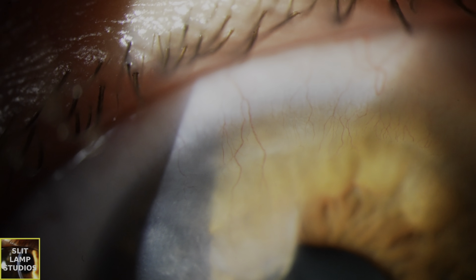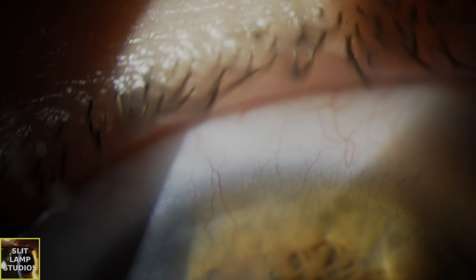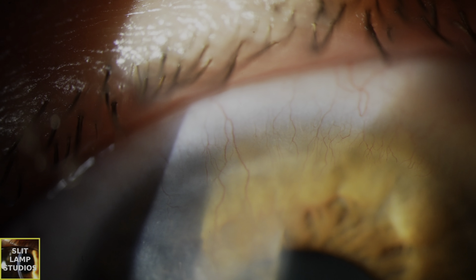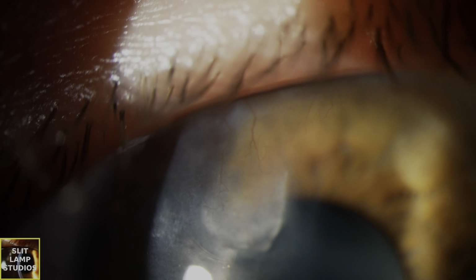Now, what I want to show you in this case is how we can tell whether this neovascularisation and active lipid deposition is active. And if you look carefully enough here, you can actually see the individual red blood cells flowing through those new vessels which are leading from the limbus onto the corneal surface and into the area of deposition. You can actually see those red blood cells moving here. That's on high magnification. Can you see that? Quite a remarkable view that we can actually see individual red blood cells moving.